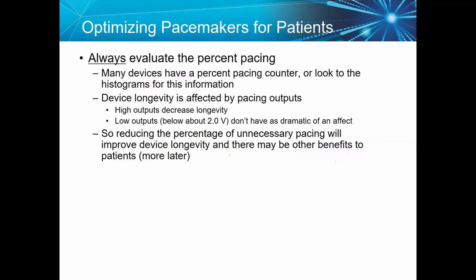And always evaluate pacing percent. Many devices have a percent pacing counter, or look at the histogram. Device longevity is affected by pacing output, and I inform every fellow that when we put in a pacemaker, we try our best to prevent unnecessary pacing. We encourage intrinsic conduction.